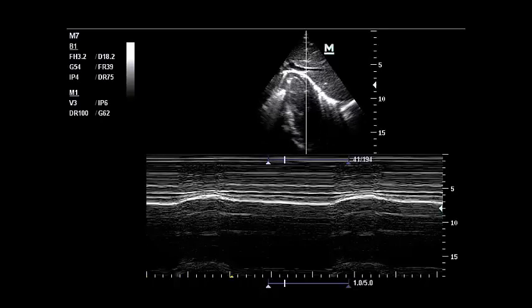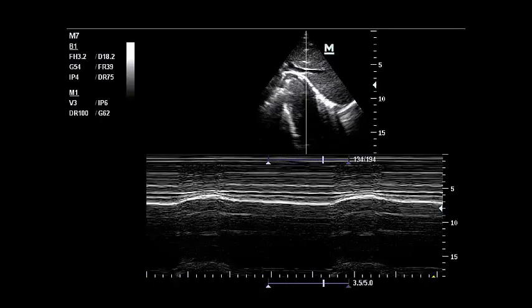First, look at the inferior vena cava. Usually, in my protocols, I need a step-by-step approach. I need to organize myself before touching the patient with the probe. So, first, please go to the inferior vena cava. If you see the inferior vena cava is narrow, collapsing, a flat inferior vena cava, start to think about infection, sepsis, distributive shock.